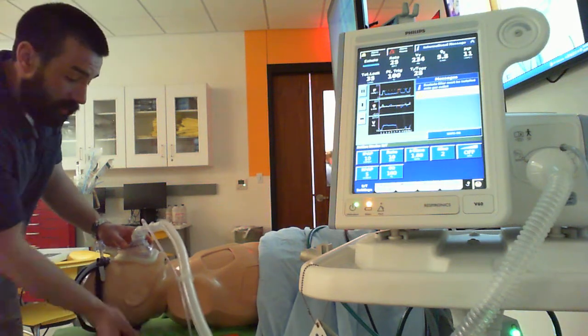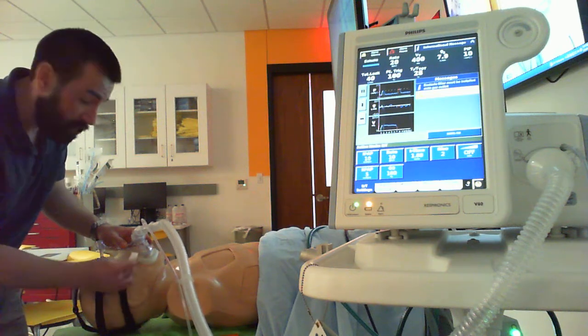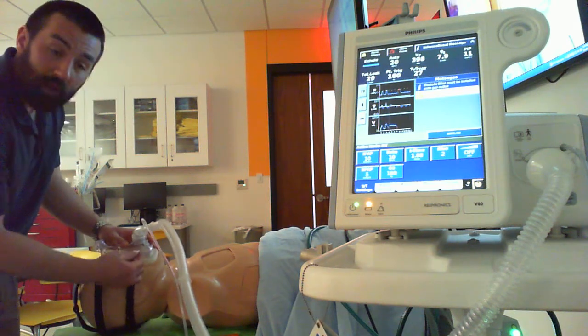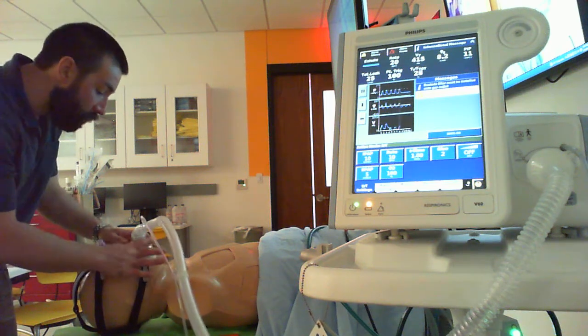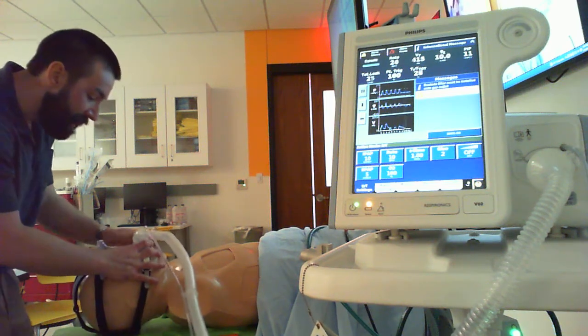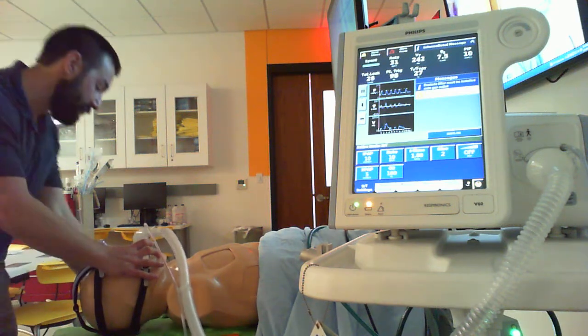What I want to do, the first order of business, the most important part of the connections is going to be these lower portions, okay? Once you get these lower portions squared away, you're going to have a pretty good seal. So we're going to start. I'm holding my mask where I like it, centered on the face, not smushing anything, got a decent leak, and clinically I want to be able to see my machine a little bit better.